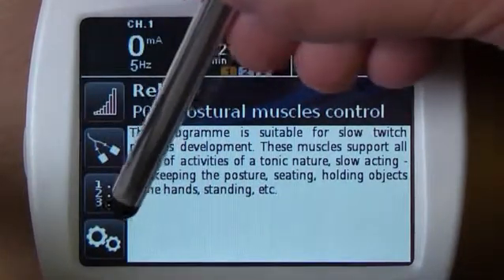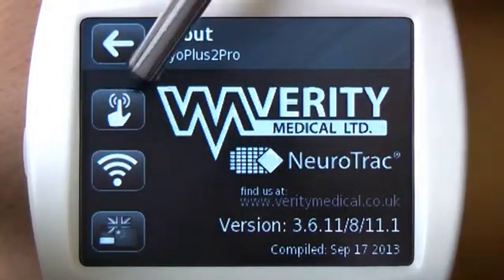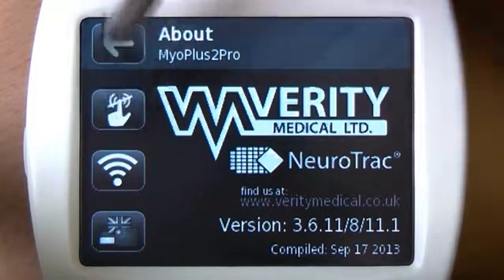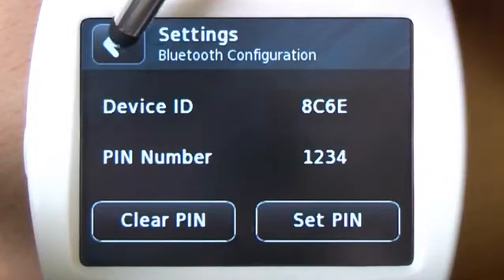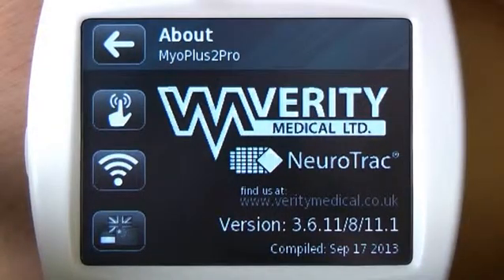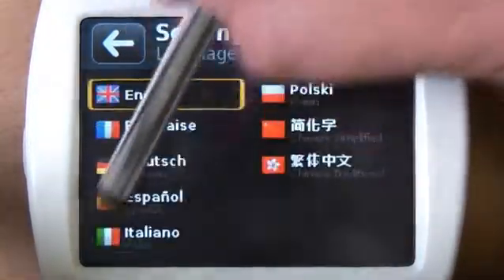The last option is settings, where you can see the device software version and you can have the following settings to review and choose from: switch on or off the touchpad sound — switch it off if you don't want to hear a click when you press the display buttons. The wireless button is to check your Bluetooth connection settings; this is for advanced users. For automatic PC connection, please leave the default values. The last button selects the language for both the LCD screen and voice prompts.